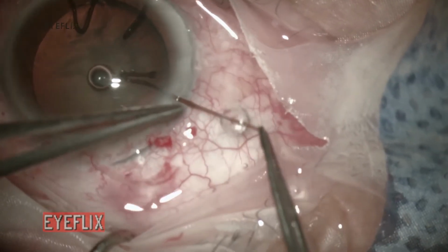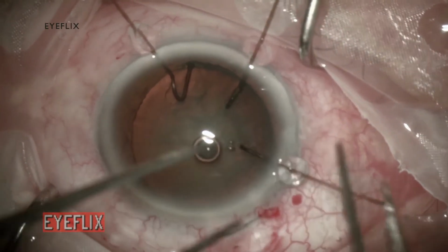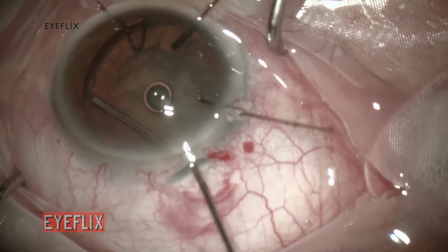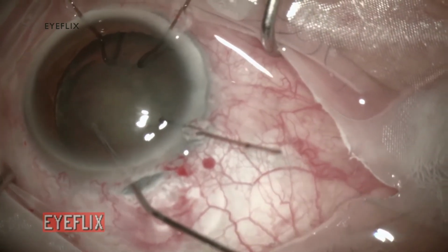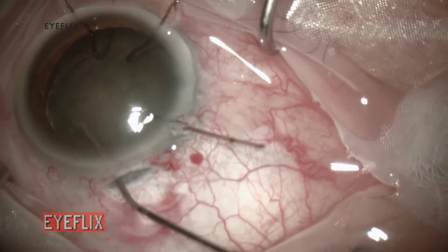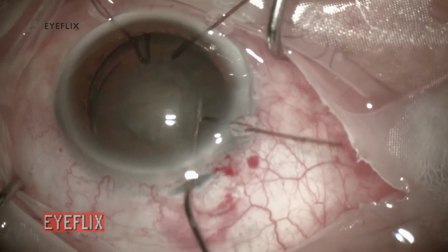Also, by keeping the posterior capsule tense and the capsular bag formed, they lessen the chances of posterior capsule rupture through phacoaspiration. Now I'm proceeding with a hydrodissection. This step is crucial to facilitate the prolapse of the heminucleus into the anterior chamber further on.